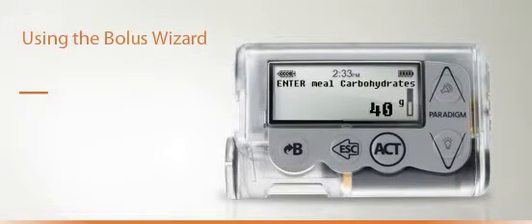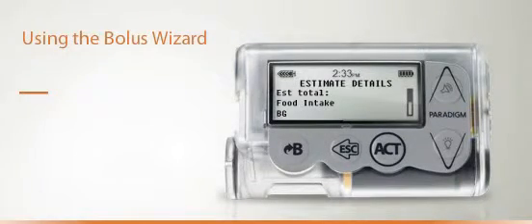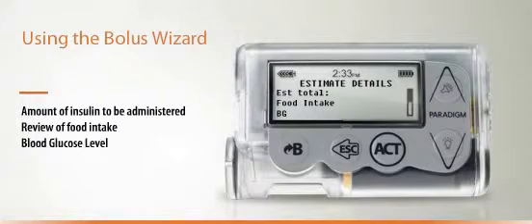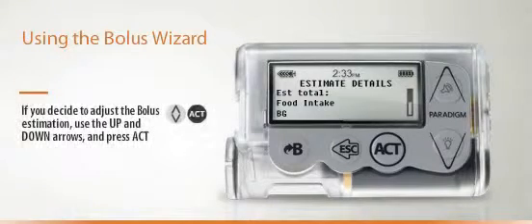You will now be given an estimate detail, which reveals the estimated amount of insulin to be administered, a review of the food intake, your blood glucose level, the food you're currently eating and the insulin needed to cover the meal, and a recommended correction bolus if needed.